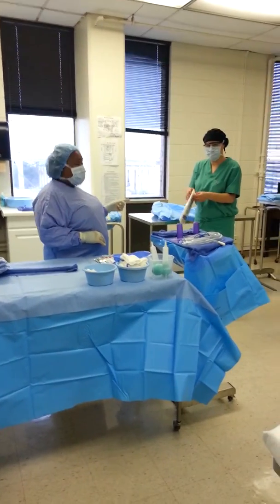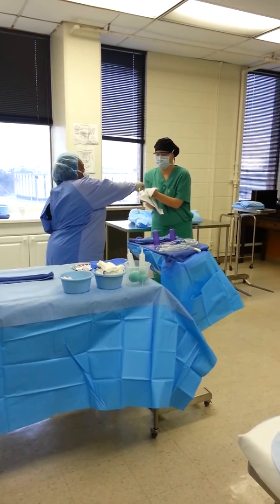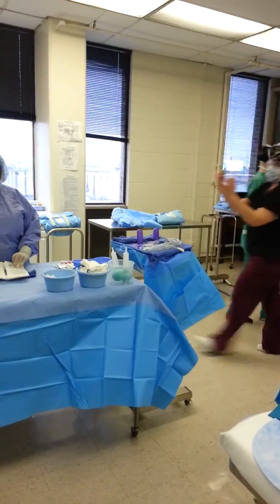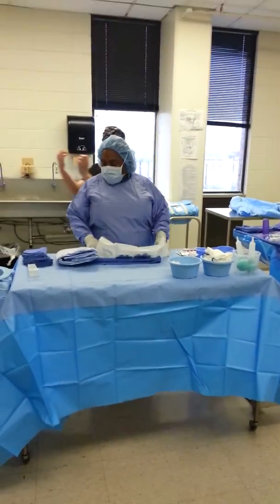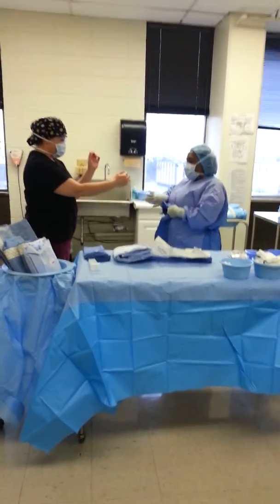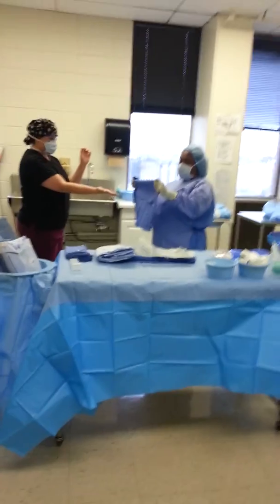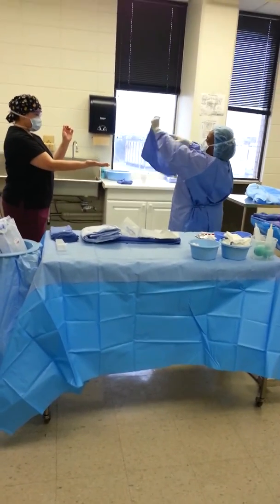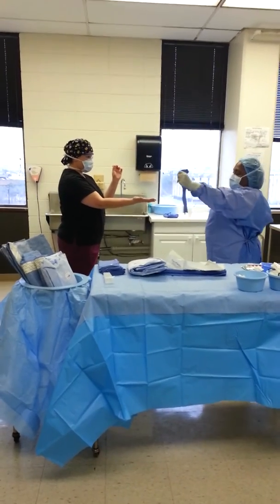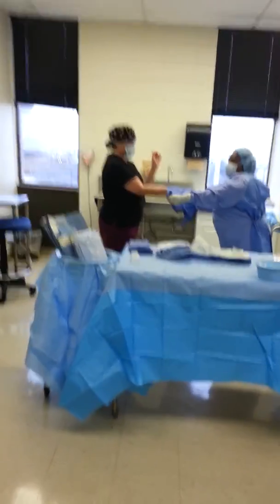Pay attention to how she's peeling open the gloves. Hold them, I'll reach in and get them out. Come on, surgeon, you don't wait for the scrub person. I'll open the towel and give you one hand only. Extend it open like a pancake. I take the towel at the sides, not like this, long ways. I'm a distance away. I made sure she felt it. You saw her arm go down?